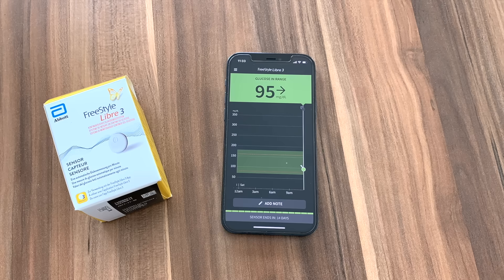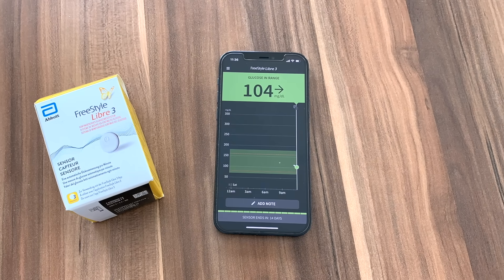The good news is that with both G7 and Libre 3, the lag between blood readings and sensor readings got shorter compared to their predecessors. G7 and Libre 3 provide more real-life glucose information. In my personal experience, the lag is really no more than 5 minutes.